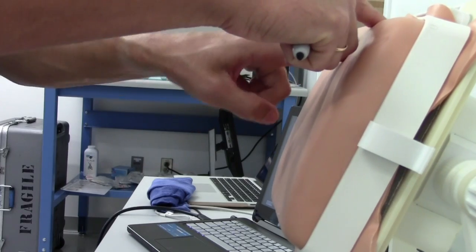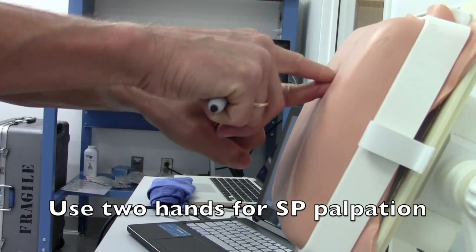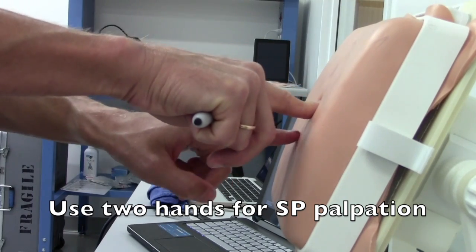Step 1. Count and mark the spinous process of T7. You can do this by using both hands for spinous process palpation.